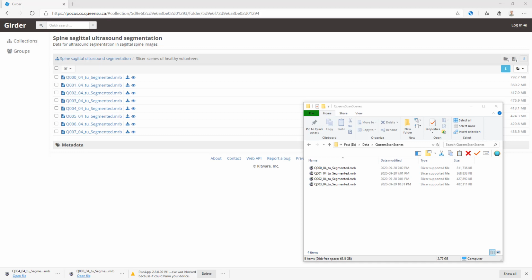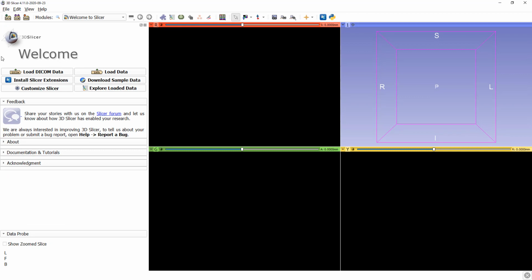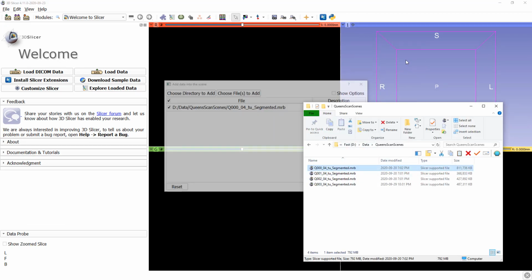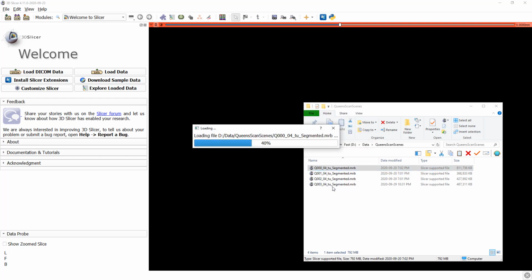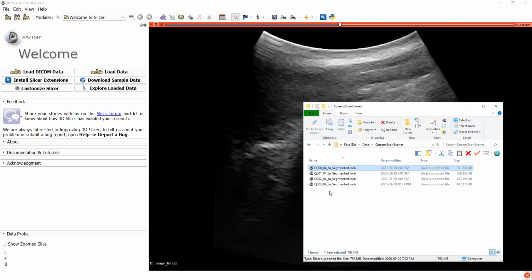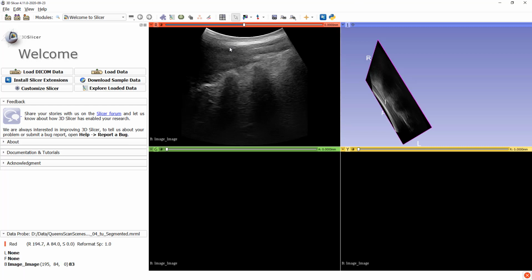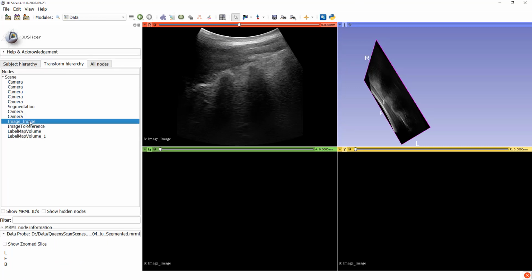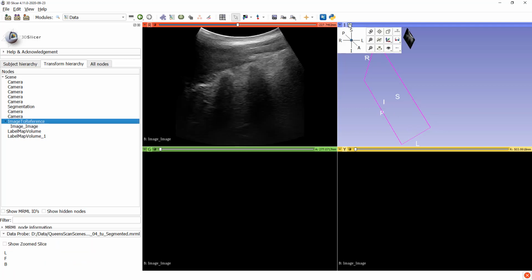You can download from this website, pocus.cs.queensu.ca, the training data sets that we have used for training the spine segmentation U-Net that we are going to be using today. And you can also download the original recorded Slicer scenes, which contain the time series that was recorded in these tracked ultrasound acquisitions.